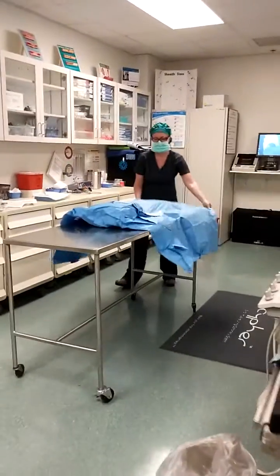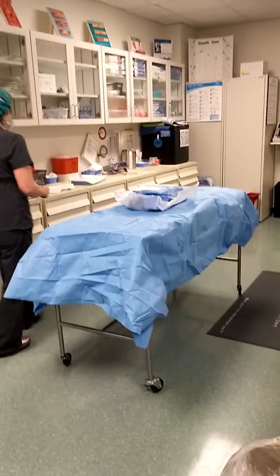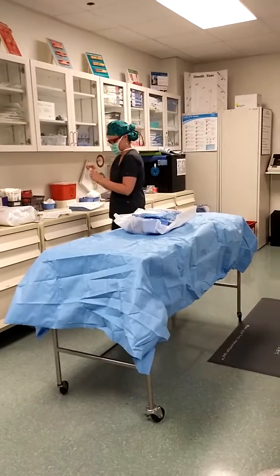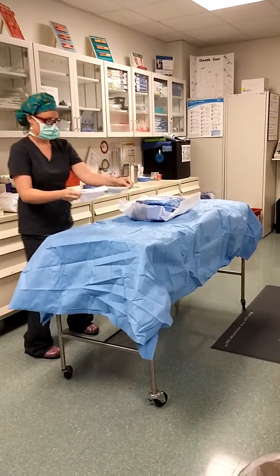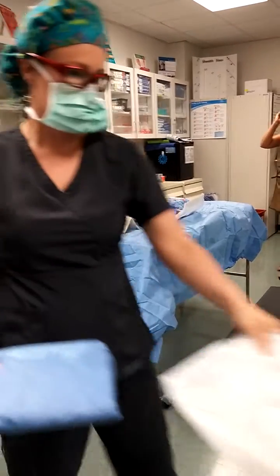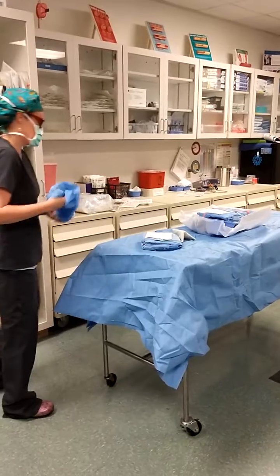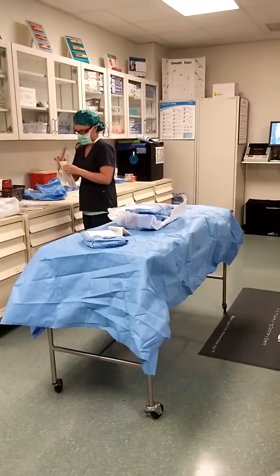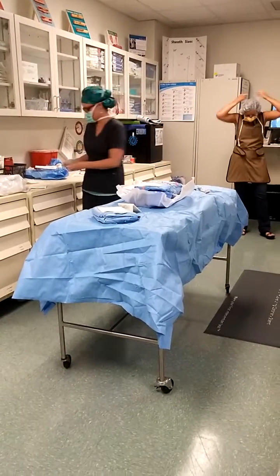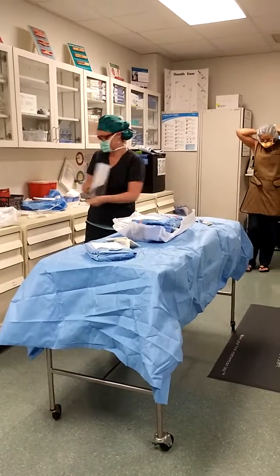This is before I go scrub, obviously. It's at this time that the patient is going to be getting on the table and your circulator, your monitor, is going to be hooking them up to the blood pressure, heart rate, pulse ox, capnography, maybe some oxygen. We're going to be opening a lot of stuff. This is a femoral case, by the way.